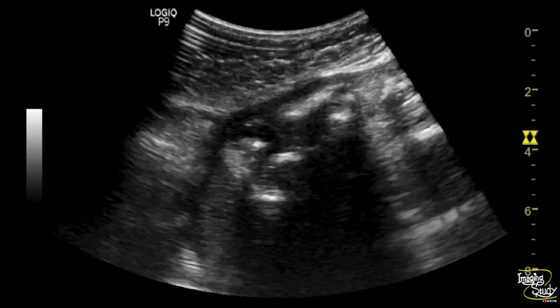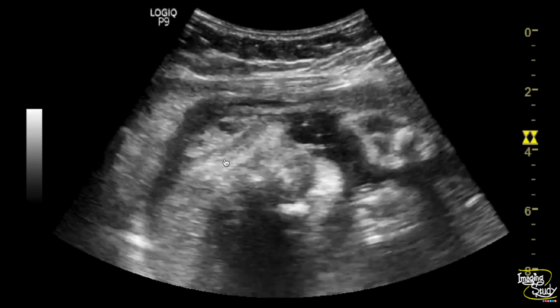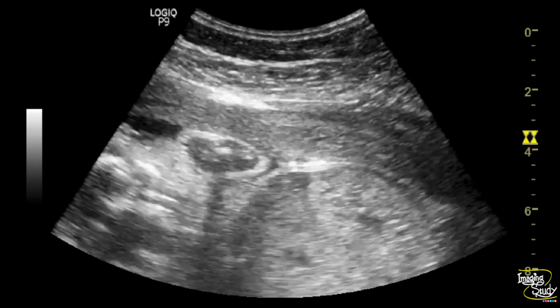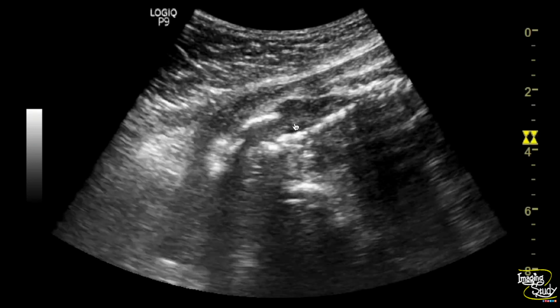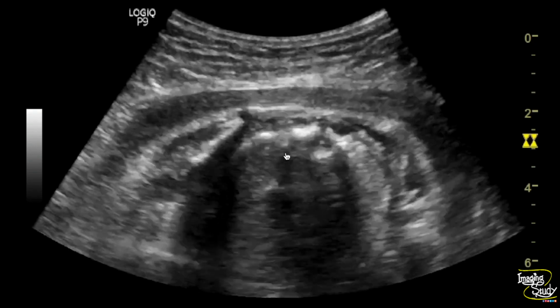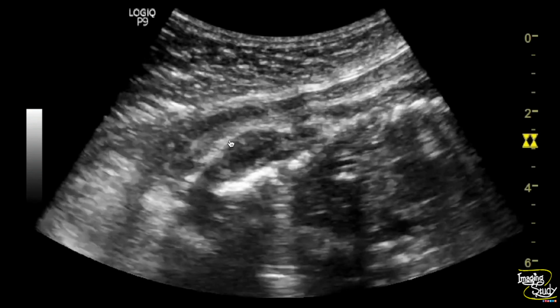The fetus is having gross oligohydramnios because of renal dysfunction. Here you can see the facial region. Now let's again look at the cervical spina bifida. This is the transverse section. You can see the splaying of the spine. This is the normal spine, and here you can see the splaying at the cervical region in cross and longitudinal sections.